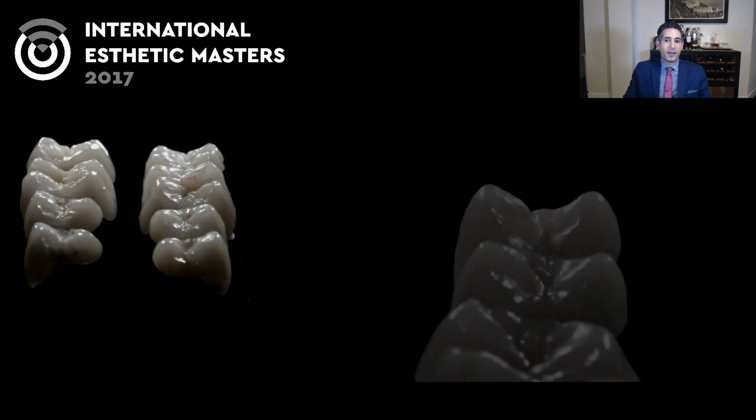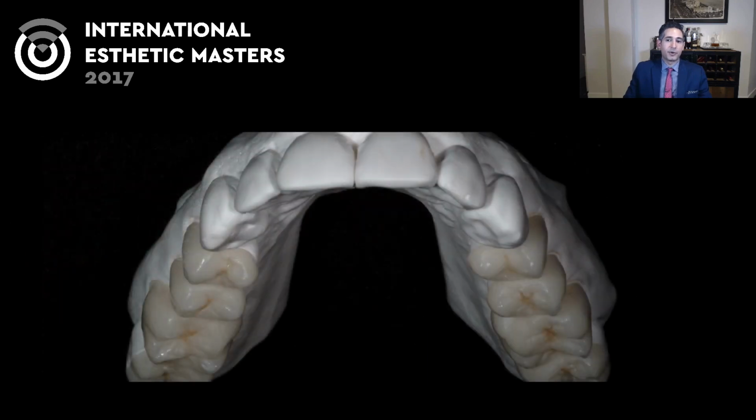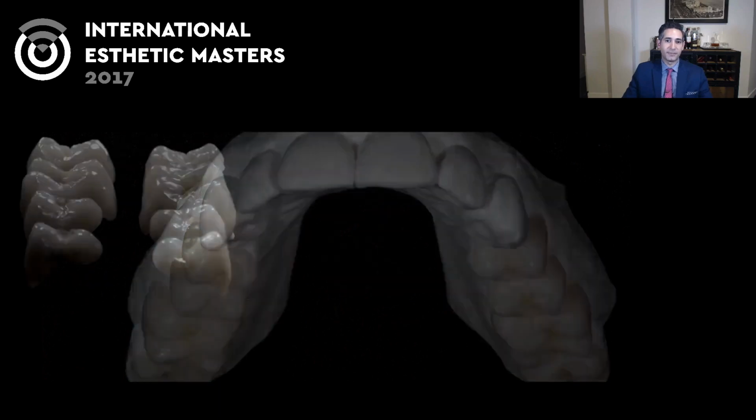These are the restorations. These are the provisional restorations that we make. So at this stage, I'm going to go back to that real quick. At this stage, when we have the final preparation, I either have an indirect provisional I make myself or a shell provisional that the lab has made for me that I will reline. And I reline it with acrylic. For this, I would use, again, either new outline if I'm doing indirect, or jet acrylic if I'm going to go intraorally just to reline, because it sets a little bit faster, especially the fast set version.